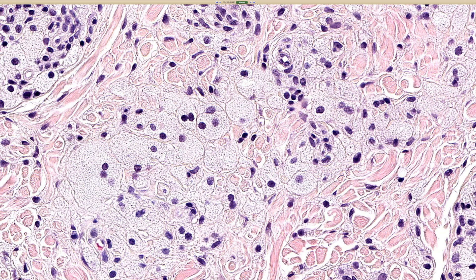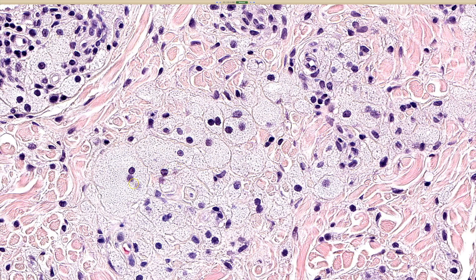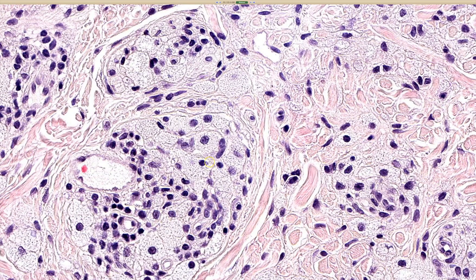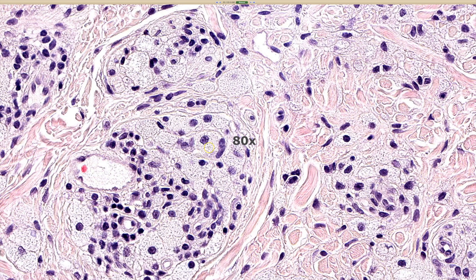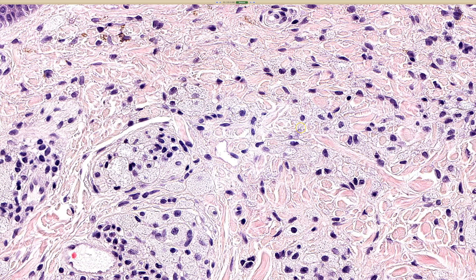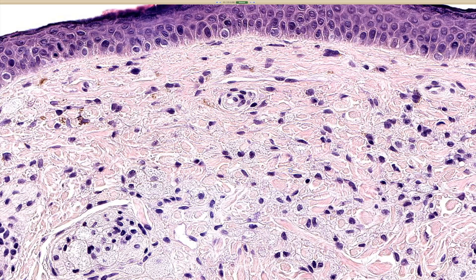Sometimes it's a little hard to tell if a histiocyte is foamy with lipid vacuoles, or if it's granular — there can be a little bit of overlap between those patterns. What helps me is that foamy cells actually have discrete little clear bubbles, and they often bump and indent into the nuclear membrane because they're lipid — little spherules not dissolvable in water, so they push everything out of the way, including the nucleus or the rest of the cell.